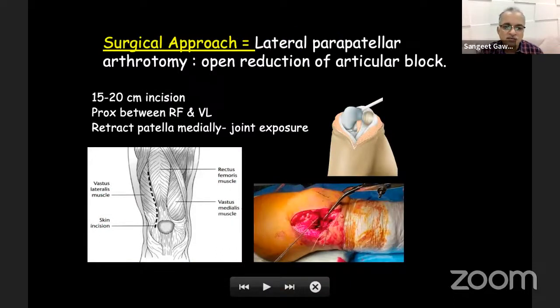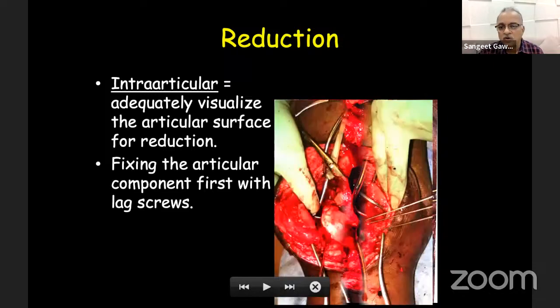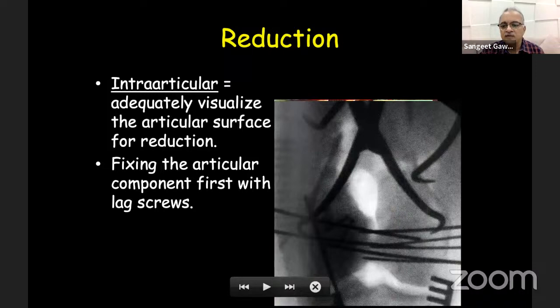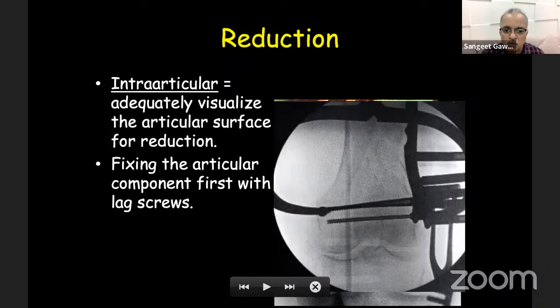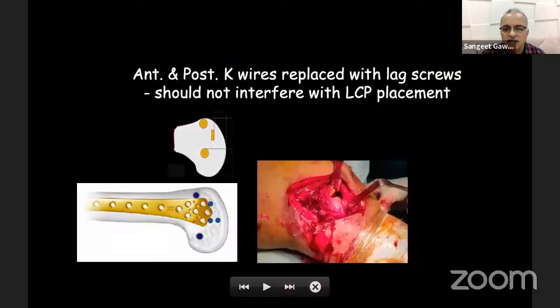between the rectus femoris and the vastus lateralis. Retract the patella medially, and once you flex, you have the entire distal femur. You can do an intra-articular reduction with reduction forceps and temporary K wires, which go across and reduce the fracture. Once you reduce, you pass the wires across and then replace them with lag screws. Once you connect the two intra-articular condyles, you connect that articular block to the metaphysis with the help of a plate. Whenever you are using lag screws, they should not be in the area where you'll have a footprint of the plate.